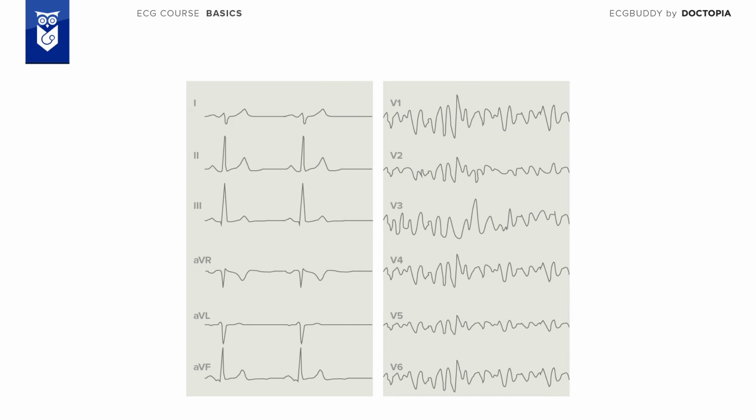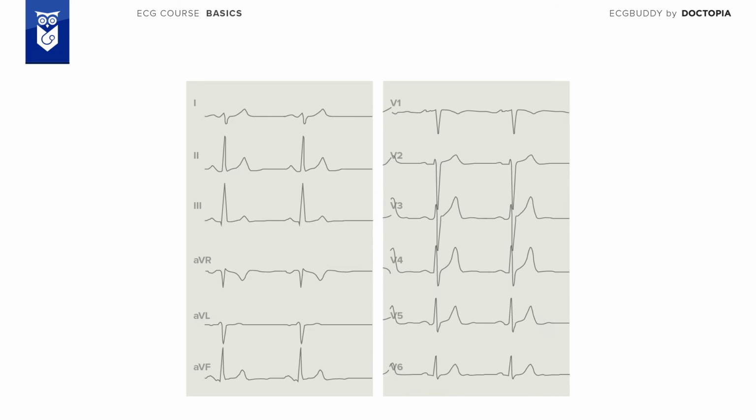One important scenario must be considered. Some ECG machines record limb leads and augmented limb leads at one time point and the precordial leads immediately afterwards. This means that, depending on the technical settings of your ECG machine, two different conduction patterns, such as sinus rhythm and ventricular tachycardia, are recorded on the same ECG. In this case, the limb leads will show one situation and the precordial leads the other.